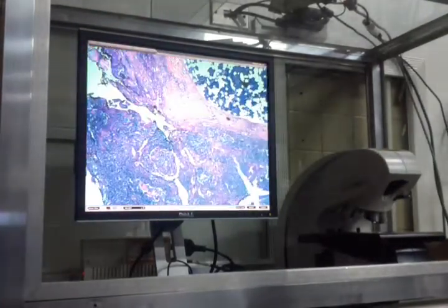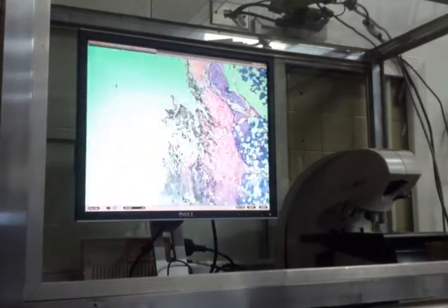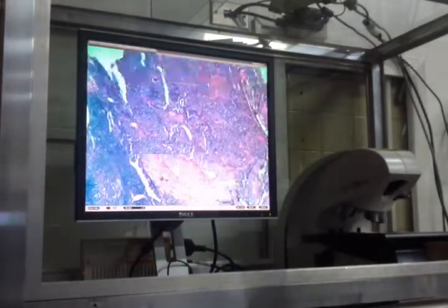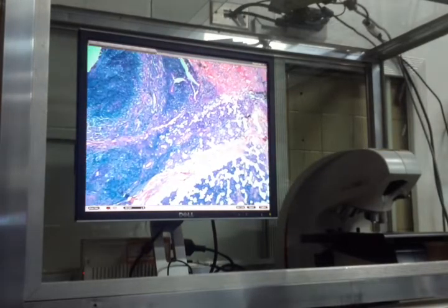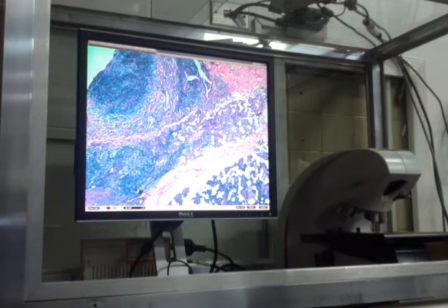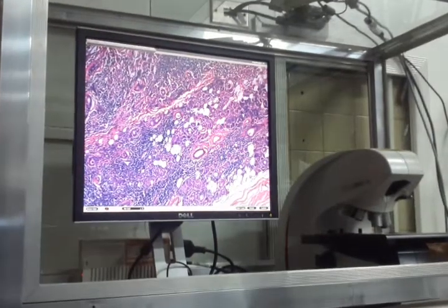Hypersensitivity type ano? Type ano yung SLE? Type 3. Okay, antigen antibody complexes. Those are tonsils yan eh. Kaya mali yung name. What you're supposed to see here are inflammatory infiltrates, mainly lymphocytic infiltrates, surrounding the blood vessels.